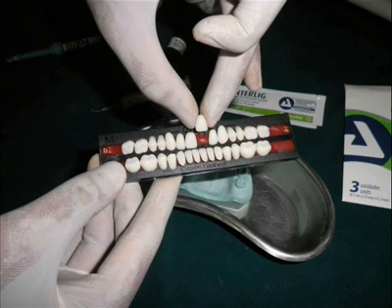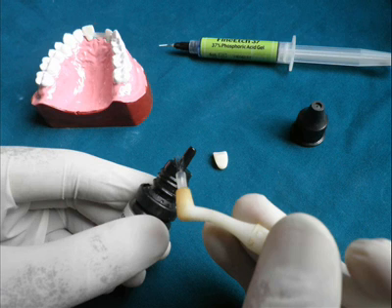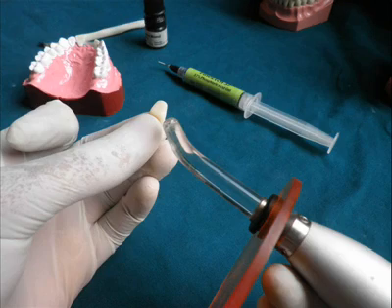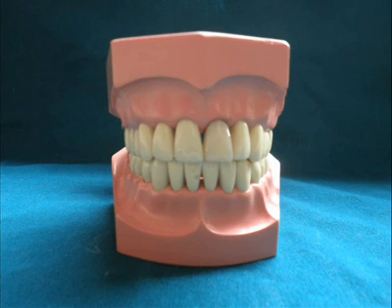Preformed acrylic tooth can also be used to replace pontics. Its palatal surface is grooved using a straight fissure bur, followed by etching its surface and application of bonding agent and light curing. This whole unit is carefully attached to the underlying matrix bed and light cured subsequently. Careful occlusal evaluation for interferences is done and relieved.